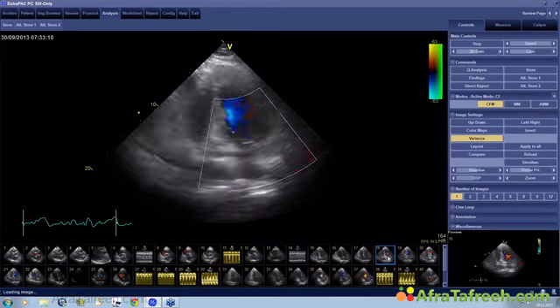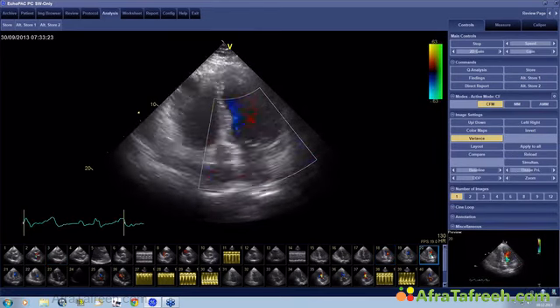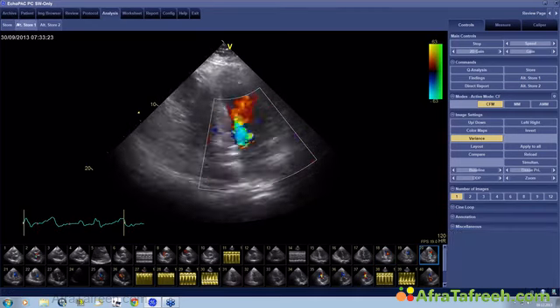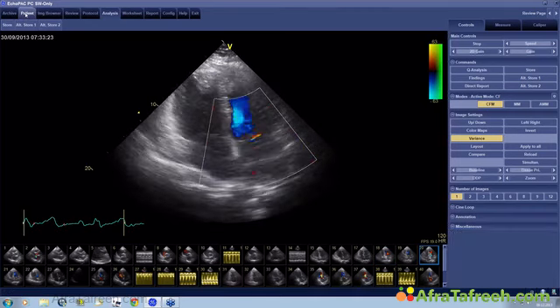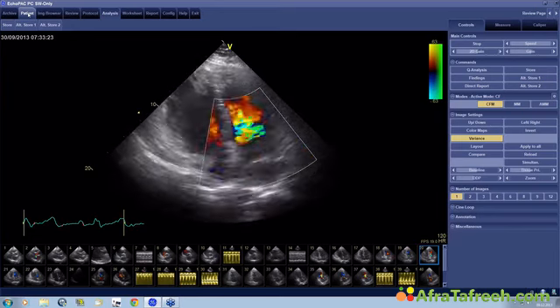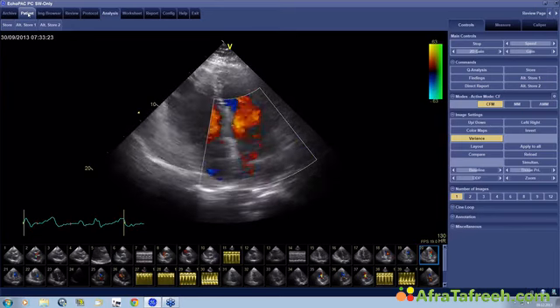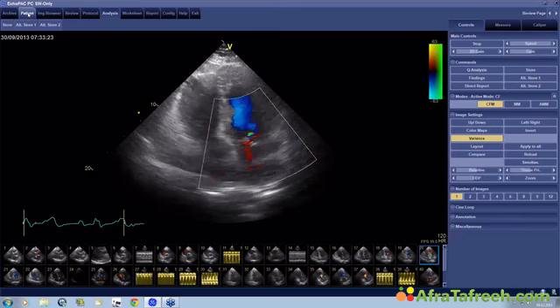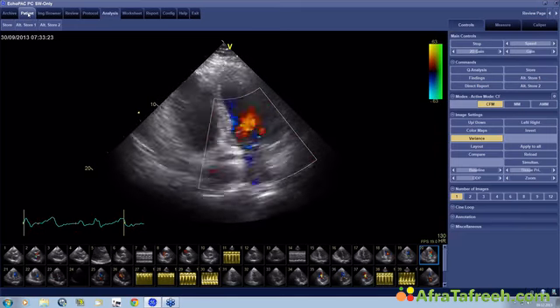And to really elucidate and find out what the problem is, we thought we just needed more information, and this could only be provided in this patient with a TEE study. Now, this is actually something very rare, because in most cases, I would say, you can really clarify the mechanism of a mitral valve pathology from a transthoracic approach. But in this patient, it was just not possible.